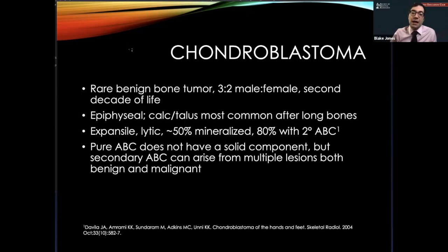But I think the important thing, which hopefully you saw in the CT image, was that the needle was targeted very well towards the solid component itself. Most people use some component of a drill. We primarily use the OnControl drill at my institution. So really try to get where there is actually a solid component, because you're absolutely right, if you are trying to drill through a cystic component in the bone, you end up getting nothing in your needle.